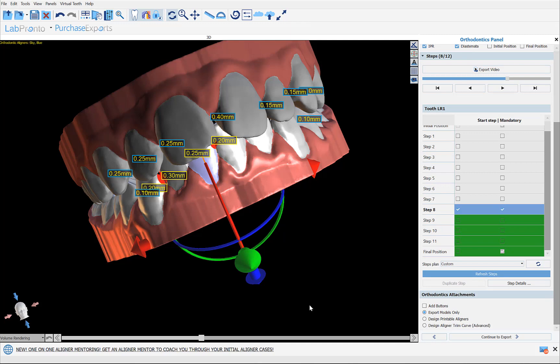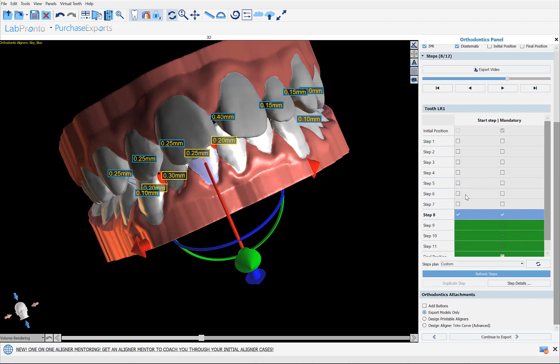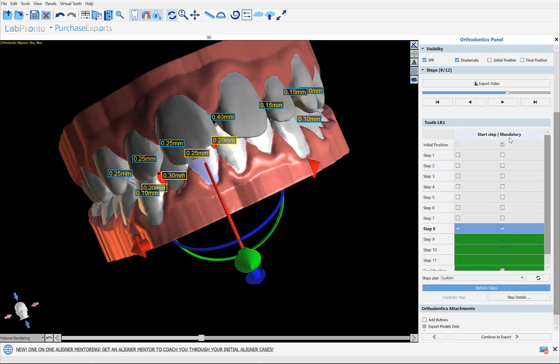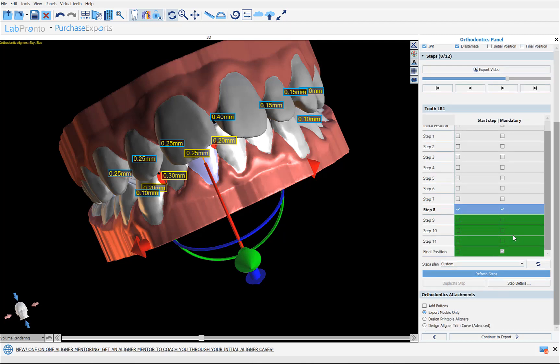To summarize: if you're happy with the tooth movement sequence the software proposes, you don't need to make changes. But if there's an IPR issue or you want to customize particular situations, you have these tools — the Start Step to dictate when a tooth begins moving, the Mandatory step to require a tooth to be at a specific position at a specific step, the dropdown for whether least-movement teeth move first or last, and the Duplicate Step option to insert a new step and move selected teeth to a new position. After any modifications, click Refresh Steps.